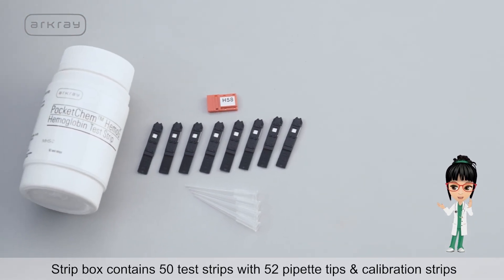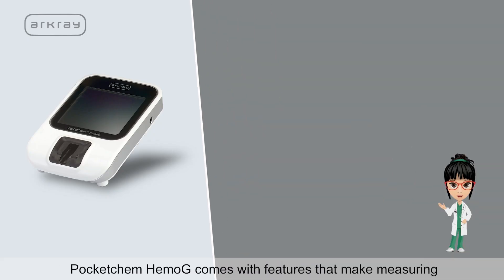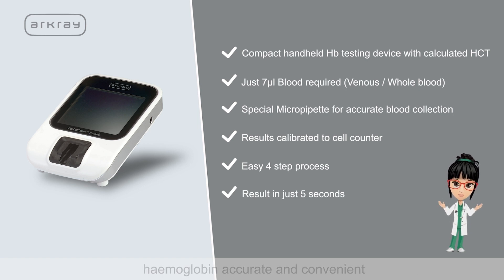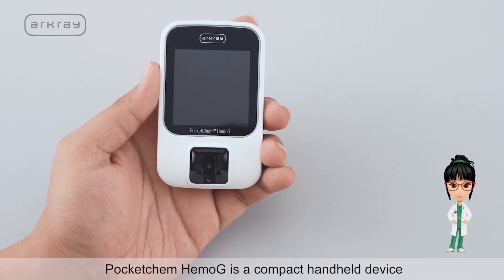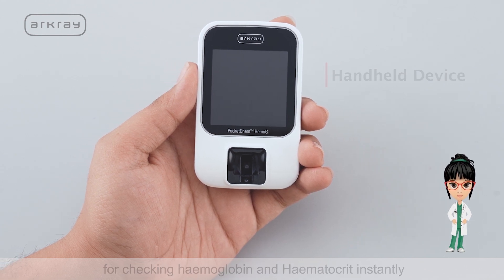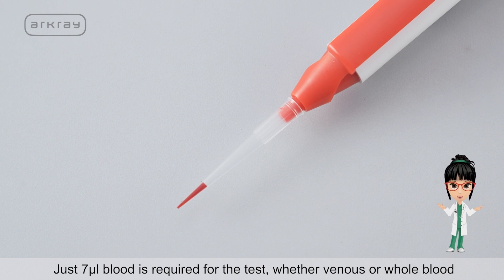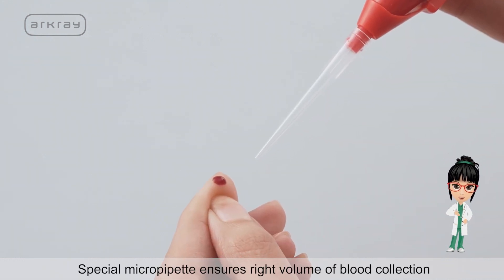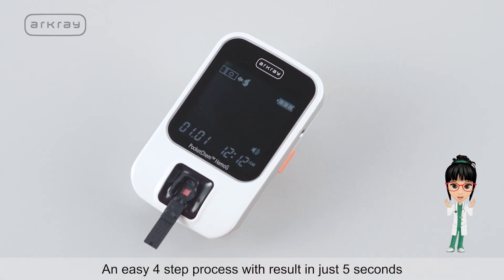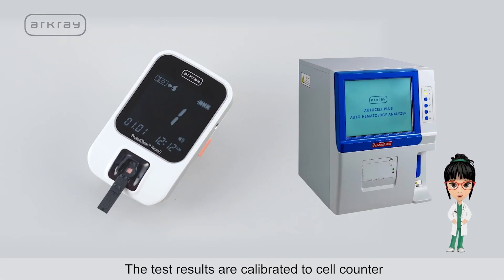The strips box contains 50 test strips with 52 pipette tips and a calibration chip. Pocket Chem Hemoji comes with features that make measuring hemoglobin accurate and convenient. It is a compact handheld device for checking hemoglobin and hematocrit instantly. Just 7 microlitres of blood is required, whether venous or whole blood. The special micro pipette ensures the right volume of blood collection, with an easy 4-step process and result in just 5 seconds. Test results are calibrated to a cell counter.